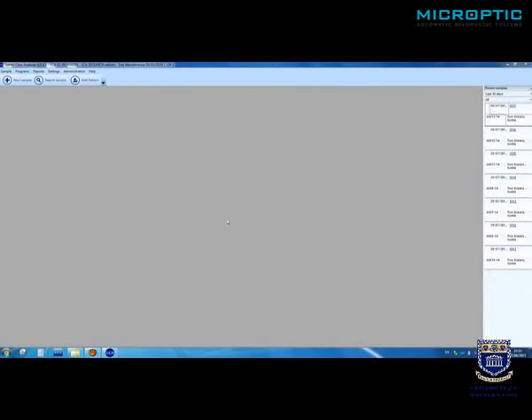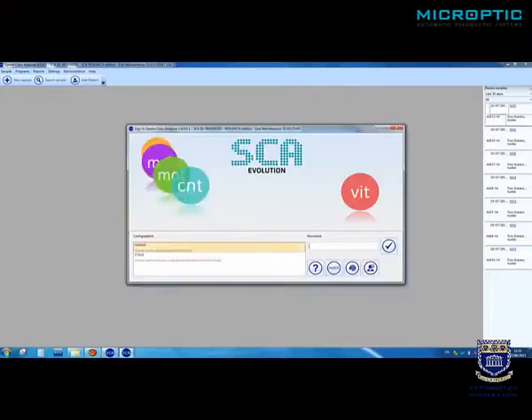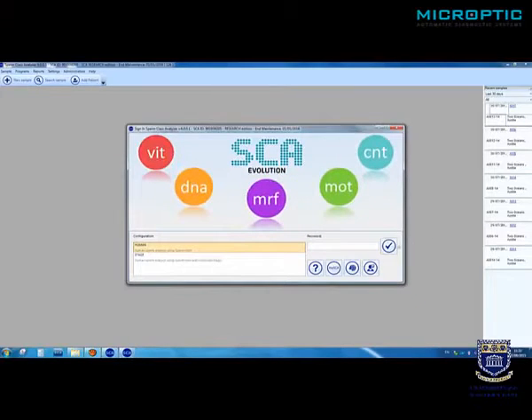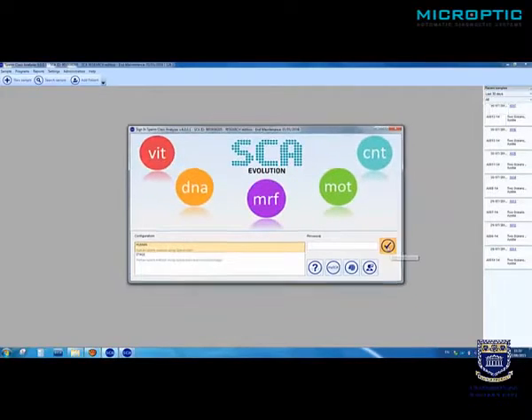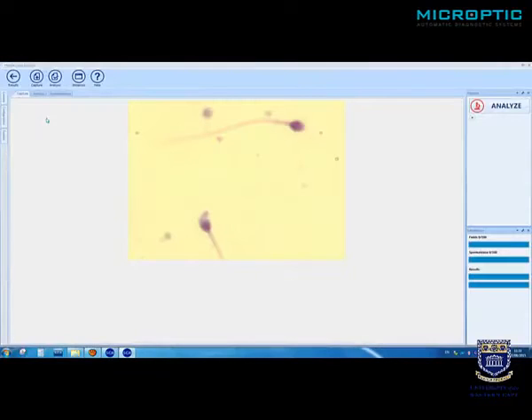We're going to show you how to do a proper morphology analysis from sperm blue stained slides. Okay, we're just starting the programs again, and this time just a very brief review of sperm morphology. We again select the correct configuration for human, and we can start directly analyzing as we have already set up the configuration nicely. We're focusing there on sperm stained with sperm blue. We analyze.